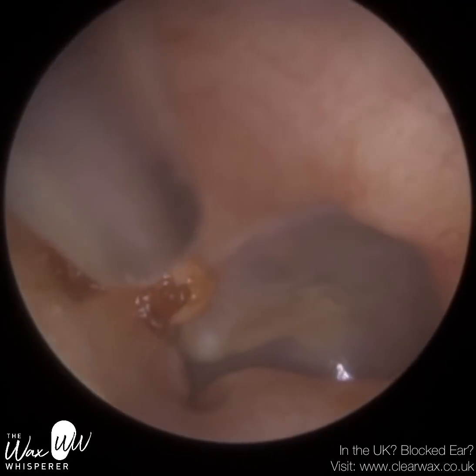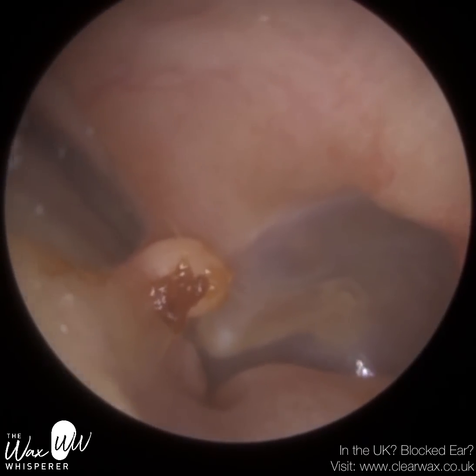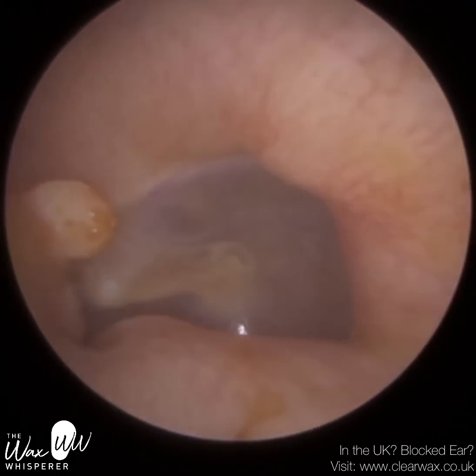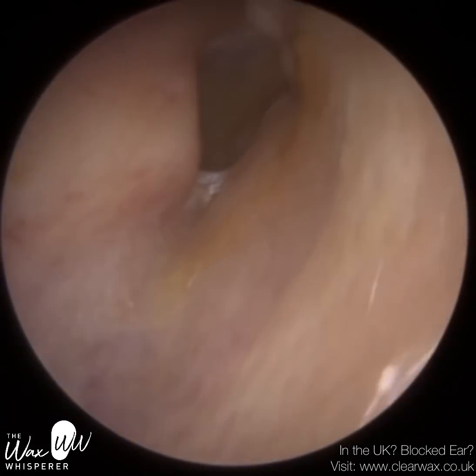So you've got the 12 o'clock one, the 4 o'clock one, and then a big prominent one at 9 o'clock. But it's not obscuring the view of the eardrum, which is healthy. This is the patient's right ear, and you'll see these bony spurs are far more pronounced.